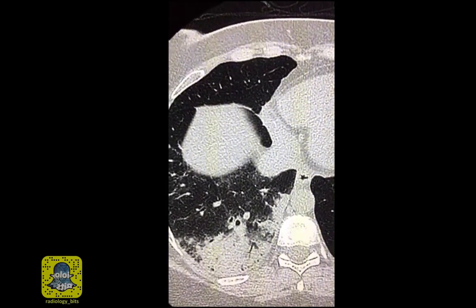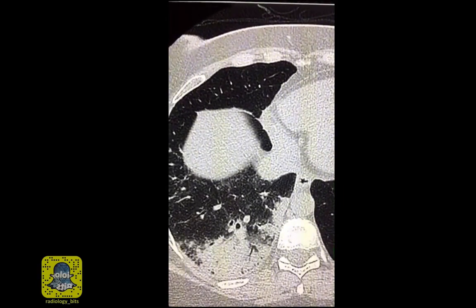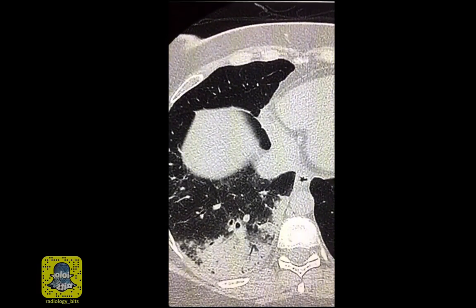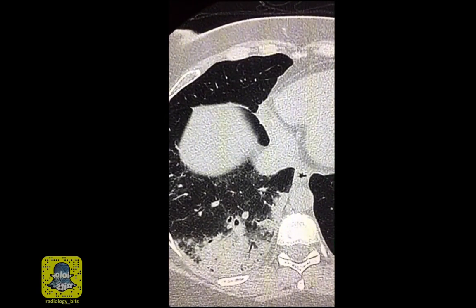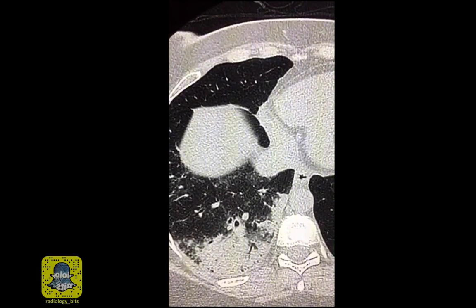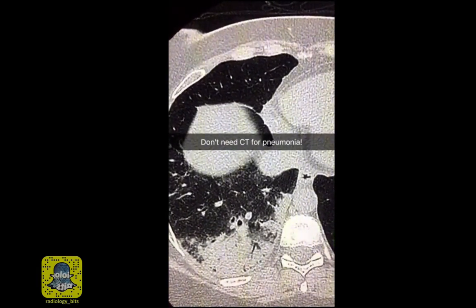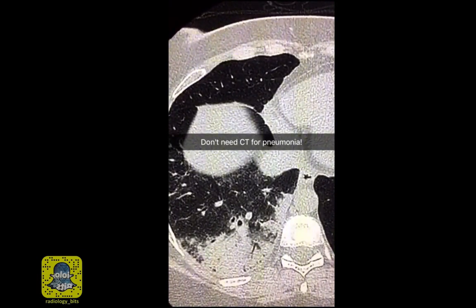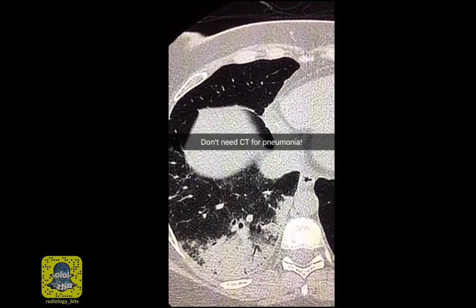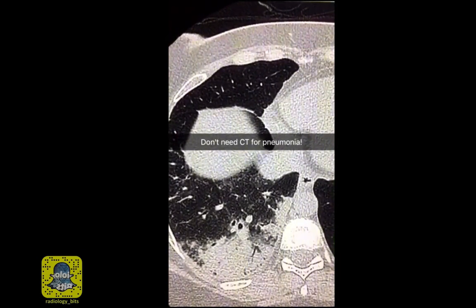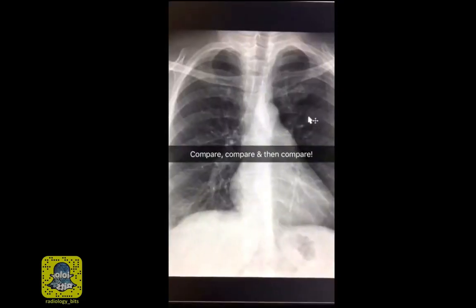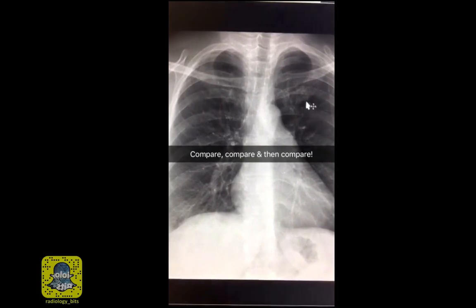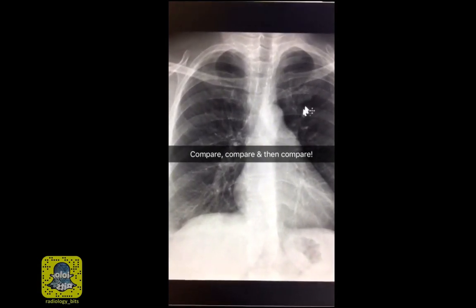If the clinician reading the initial chest radiograph had detected the abnormality, the patient would not have undergone the CT scan. As you know, pneumonia in adults is a clinical diagnosis that does not require a CT scan and could be followed clinically and with chest radiographs. The first teaching point is: compare both lungs to make sure you don't have any increase in density in one area compared to the other.